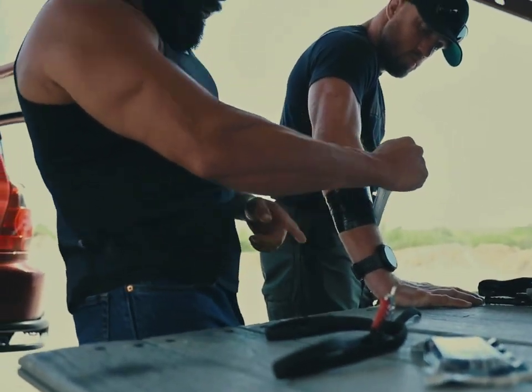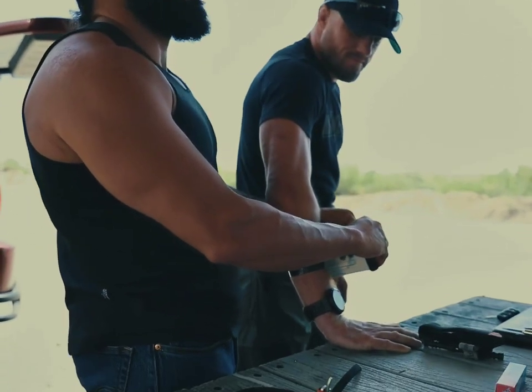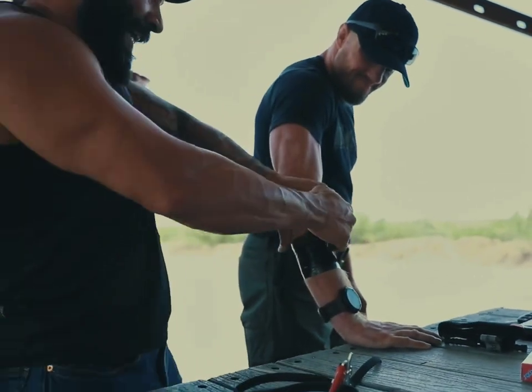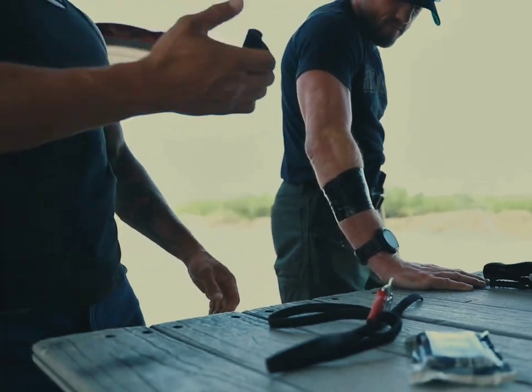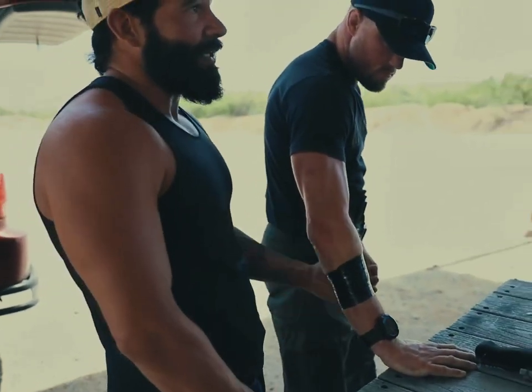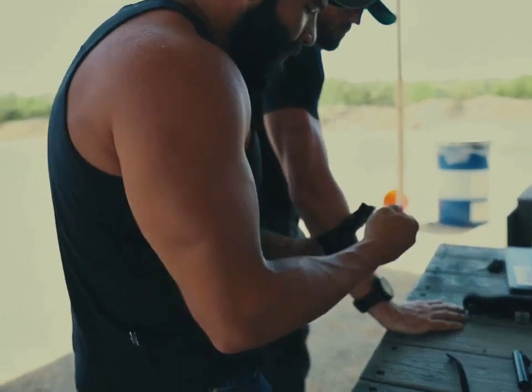As you pull, you just lay that on top. Watch this — in order to get it to pop, that's a lot of pressure. And it stays — that's the point. It self-adheres, you just get it there, hold that down, and now it's done. It's another great option.